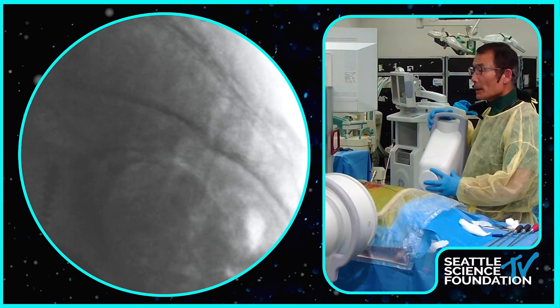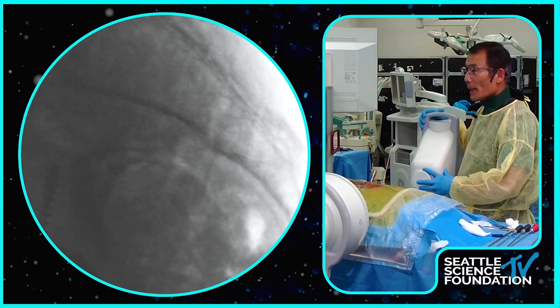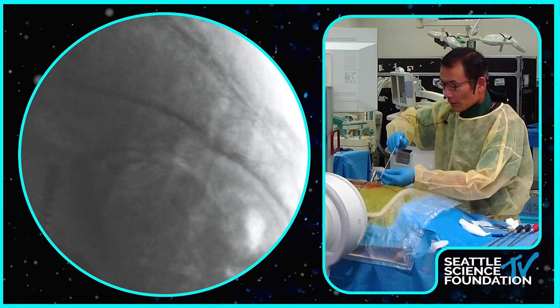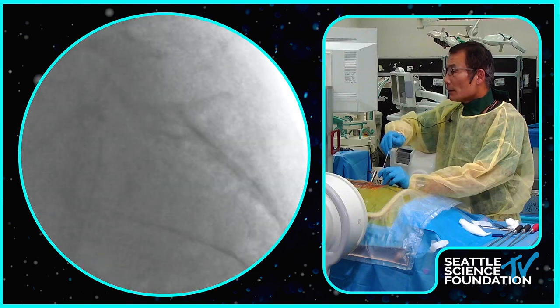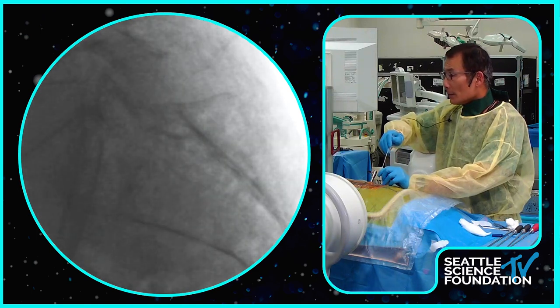Move toward the head a little bit. So my needle is way too low. Grasper. Take a shot there. Okay.